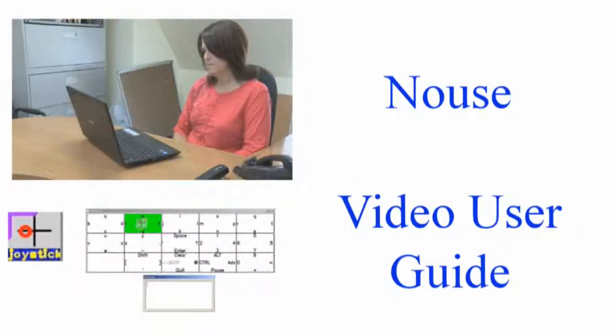We hope that you've enjoyed this video on the basic functions of Nouse. For more detailed instructions or for advanced features, please refer to your user manual.